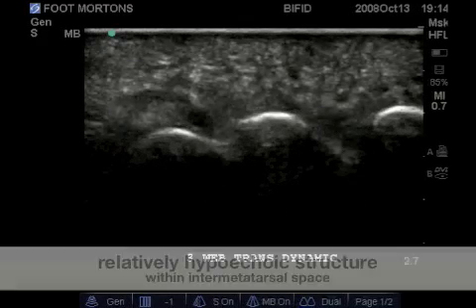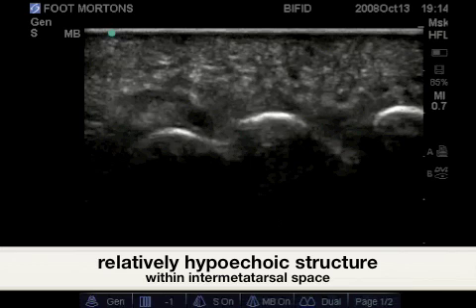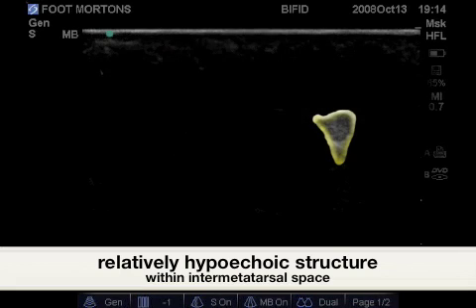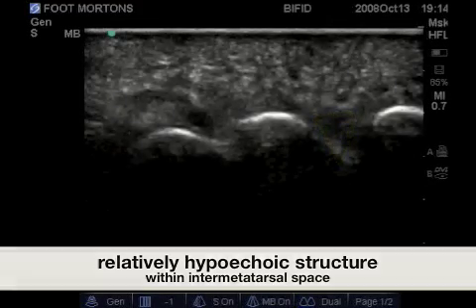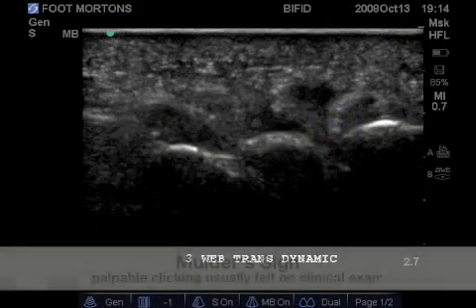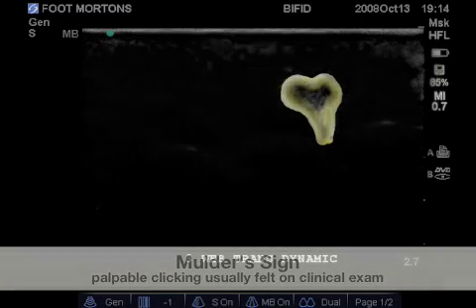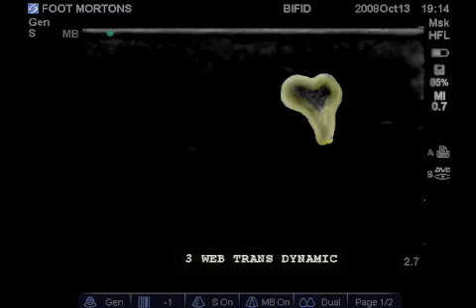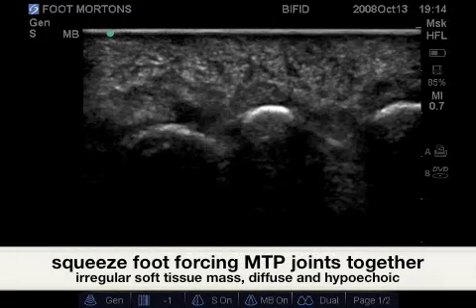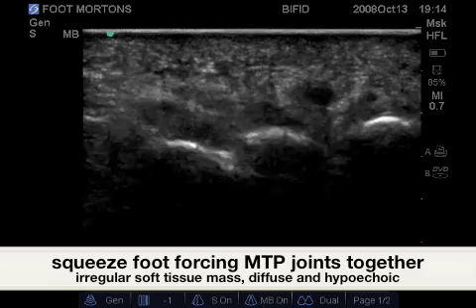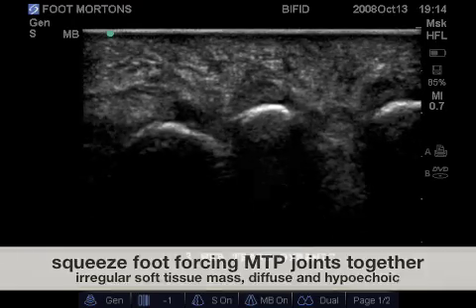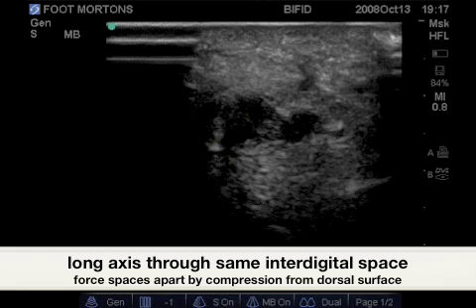The Morton's neuroma is not quite accentuated without dynamic stress. We'll highlight this structure here in yellow, followed by a positive Mulder's sign, which is a squeezing of the foot bringing the MTP joints together under dynamic stress, as seen here with releasing of the metatarsal heads and forcing them back together.